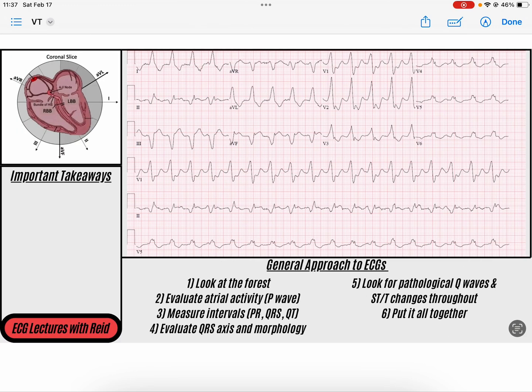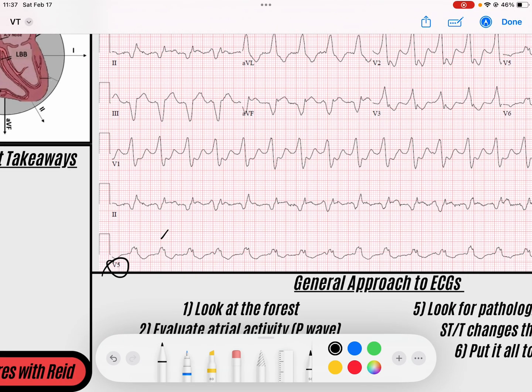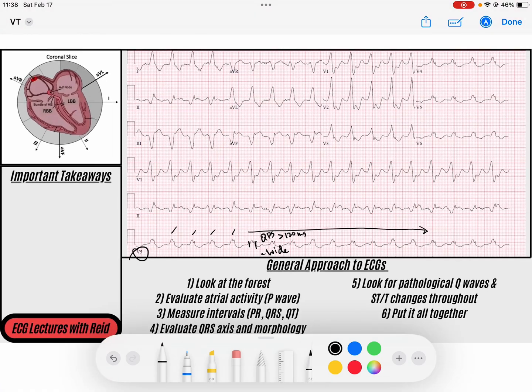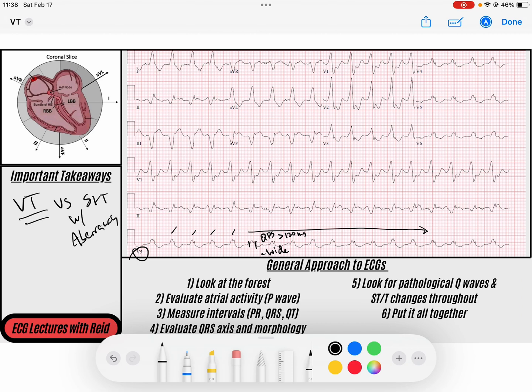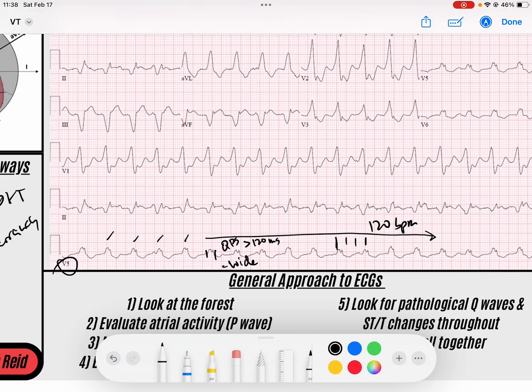Let's look at another ECG example of monomorphic VTAC. We've got a wide complex tachycardia — it's very regular throughout the entire strip and the QRS is greater than 120 milliseconds. So now we need to figure out: is this ventricular tachycardia or SVT with aberrancy? We want to rule out VTAC. Checking the rate: 300, 150, 100 — so maybe 120 beats per minute. We've got a regular wide complex tachycardia.